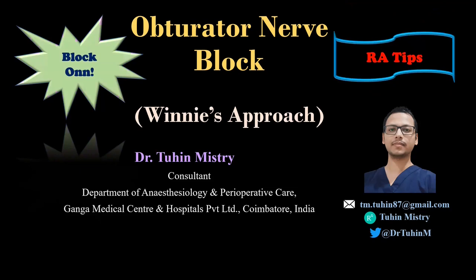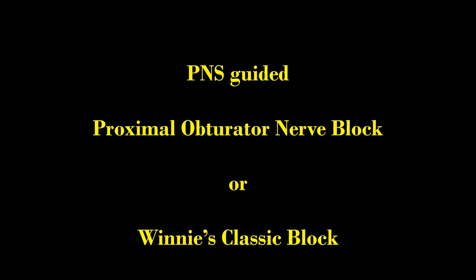In this video, I am going to demonstrate the PNS guided proximal obturator nerve block or the Winnie's classic obturator nerve block. It blocks the common trunk or the anterior division of the obturator nerve.